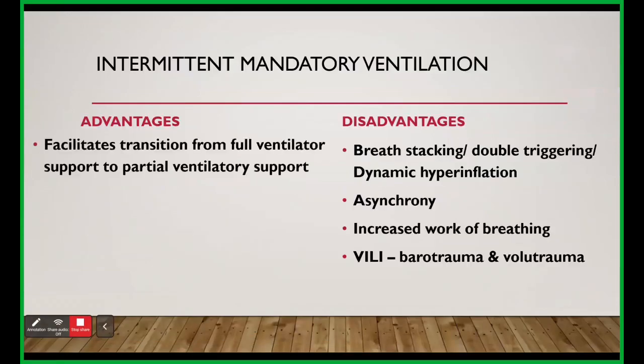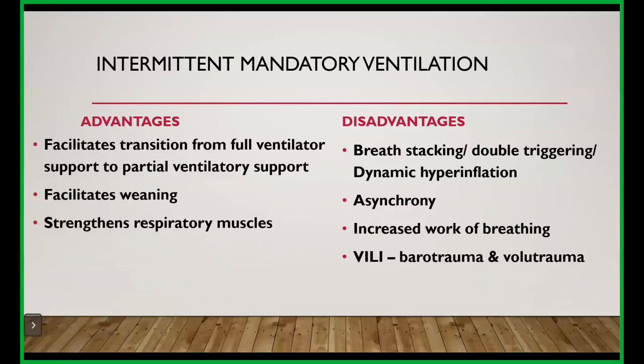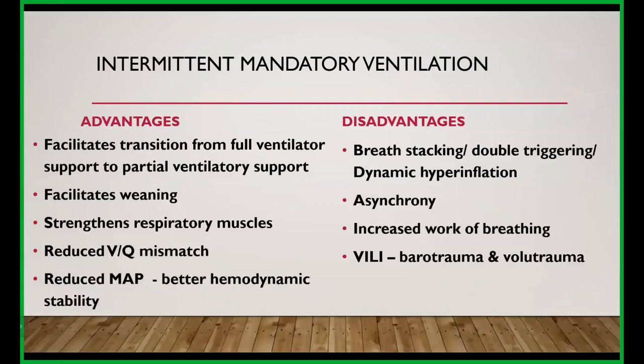Now, what are the advantages of intermittent mandatory ventilation? It facilitates weaning. It facilitates transition from full ventilator support to partial ventilatory support. Naturally strengthens your respiratory muscles, reduces ventilation-perfusion mismatch, and reduces mean airway pressure. Any mode of weaning has to fulfill these requirements.